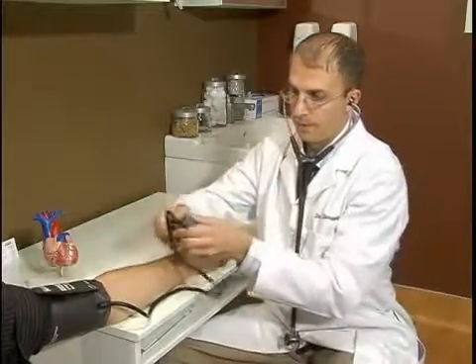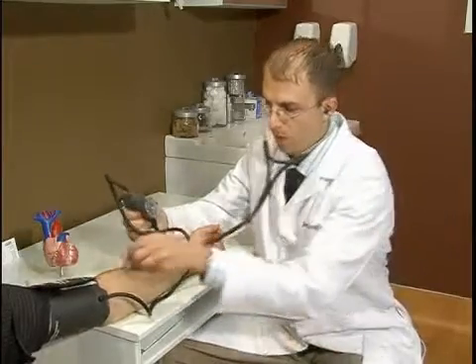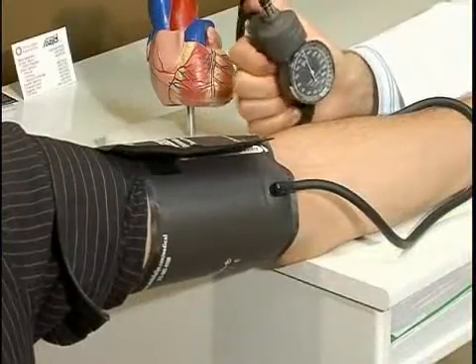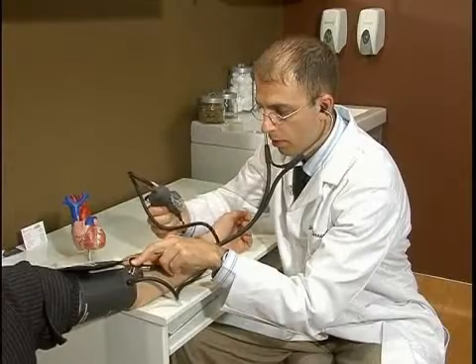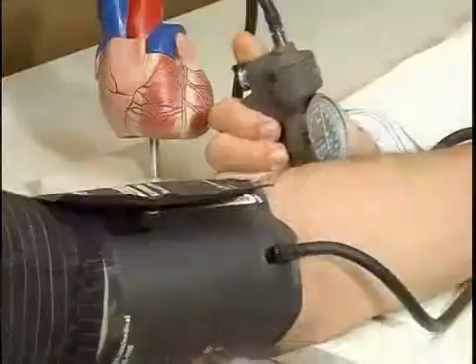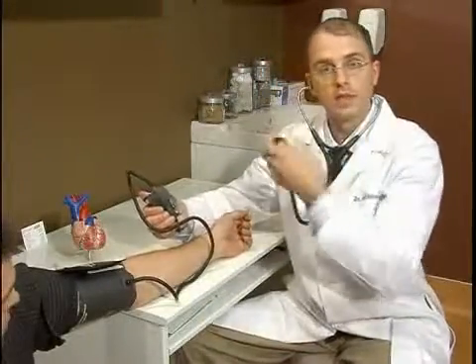So we want to increase until we no longer hear a pulse coming through that brachial artery. Then we're going to go 30 millimeters of mercury above that, and that's where we're going to stop. And that's how you inflate the cuff.